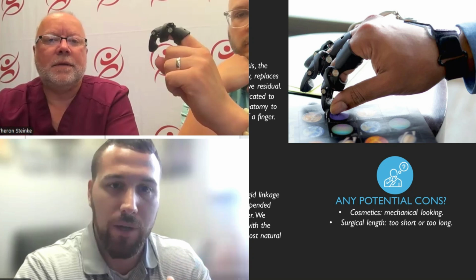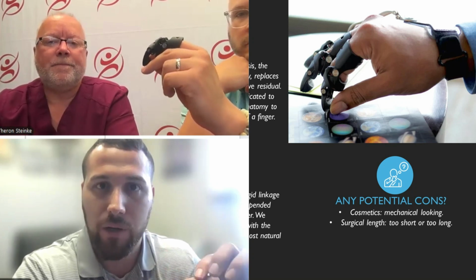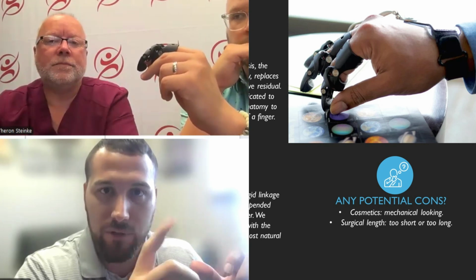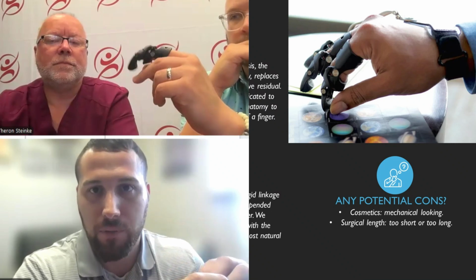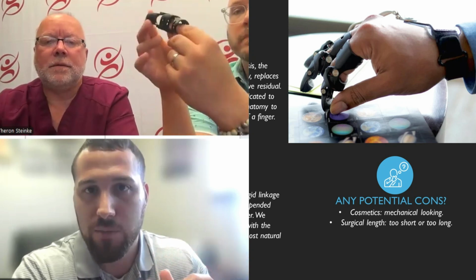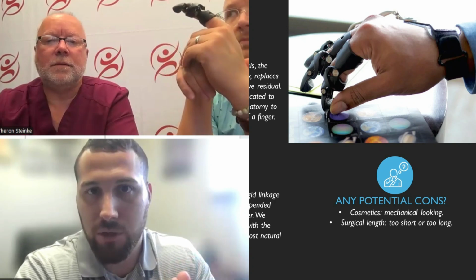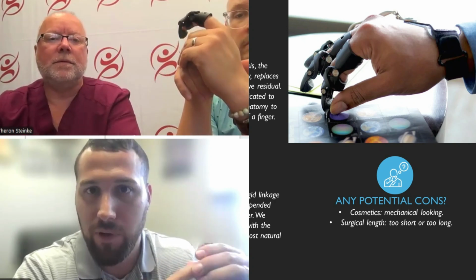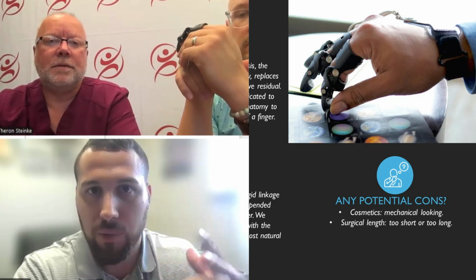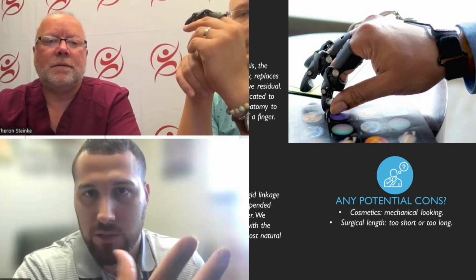So when Mike keeps mentioning the length of the limb, you have to envision a ring going up onto that finger, and not only being secure through all ranges of motion, but we also take things into account such as volume or swelling, and there are some adjustments that can be made to that prosthesis as a result. As any amputation occurs, the volume of that limb or that finger in this case can fluctuate and change. Similar to anyone who's worn a ring before, who may have to have it resized or adjusted to make sure it's not falling off.